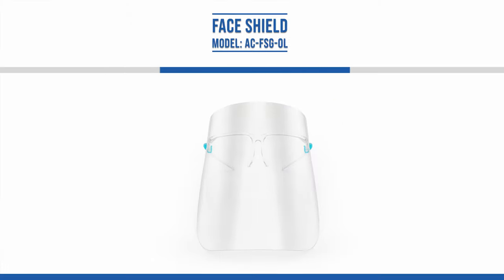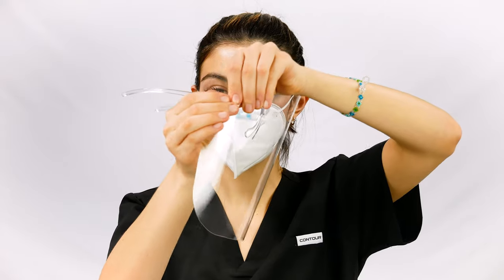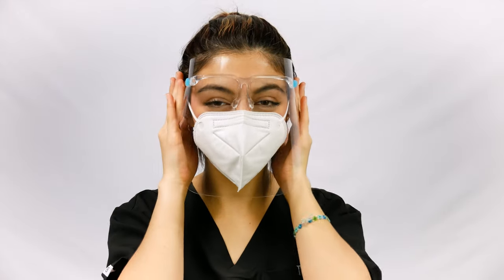Hello, and welcome to this AccuMed tutorial. In this video, we will demonstrate how to assemble, adjust, and properly wear your AccuMed face shield with glasses.